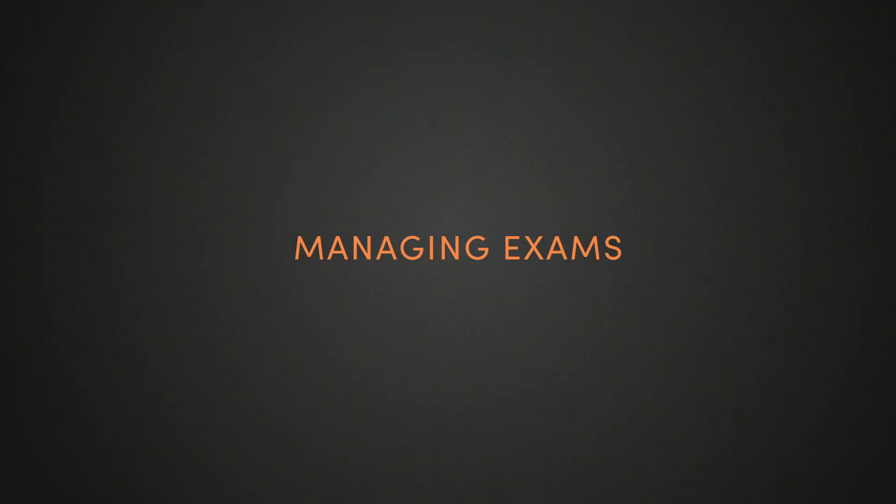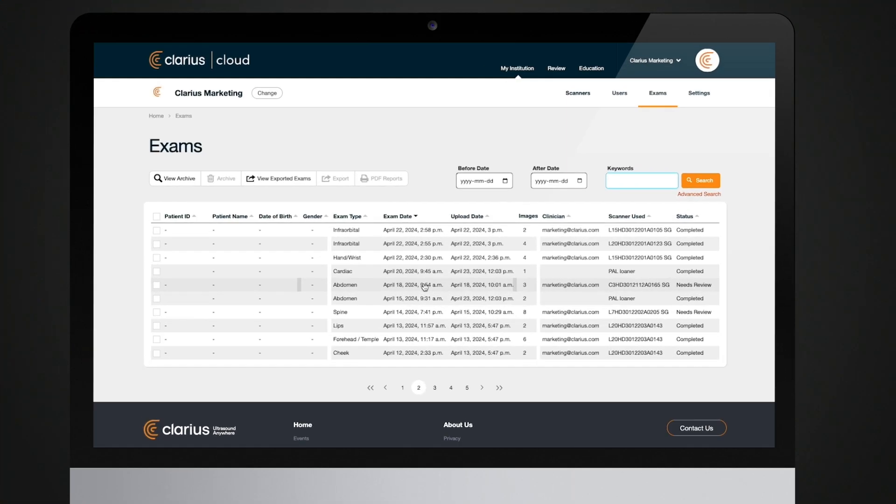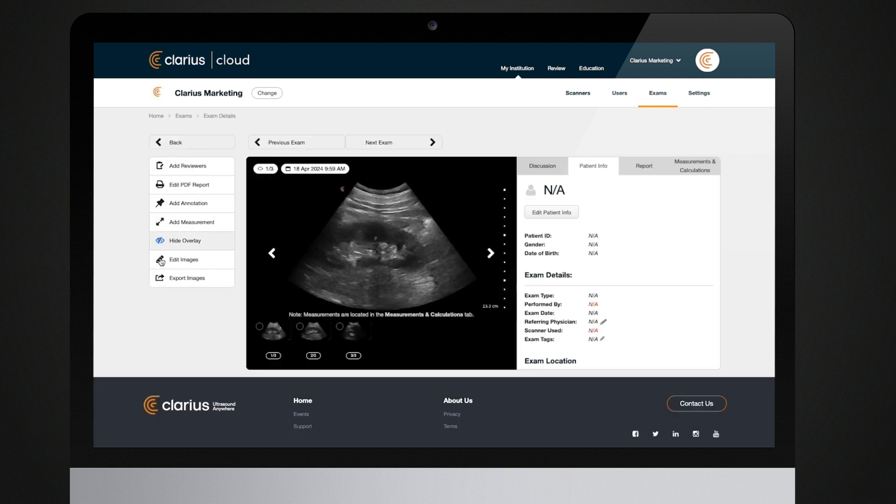Managing exams. When opening the exams page, you will see all of your exams.